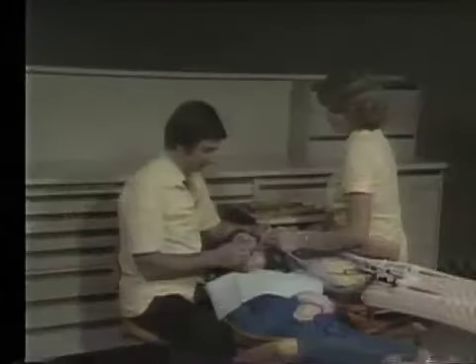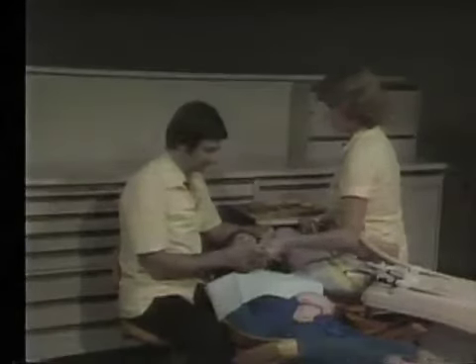The working position for the operating team, as well as the positioning of the patient in the dental chair, has a profound impact on both comfort and efficiency. When the operator, dental assistant, patient, and equipment are positioned correctly, access to the oral cavity is improved and visibility is enhanced. Patient comfort and safety are also established.